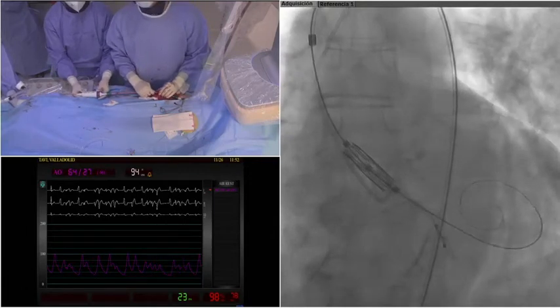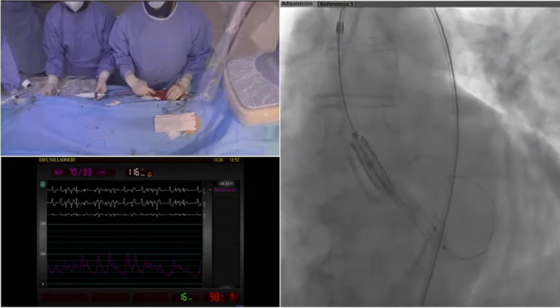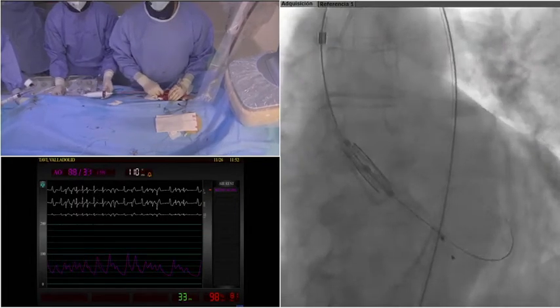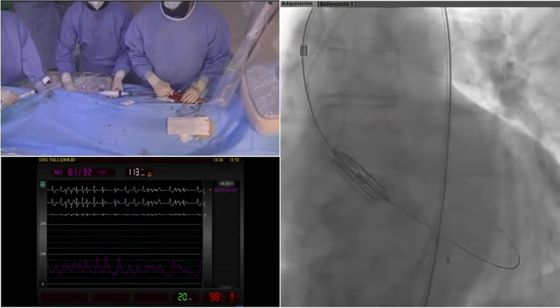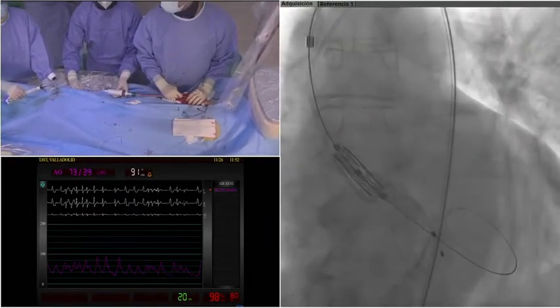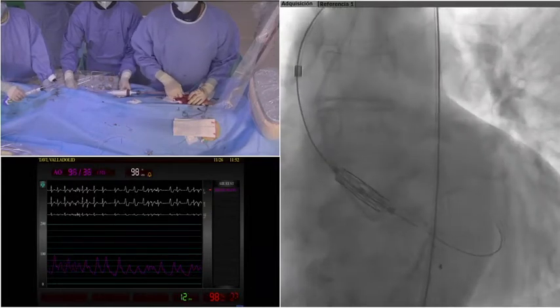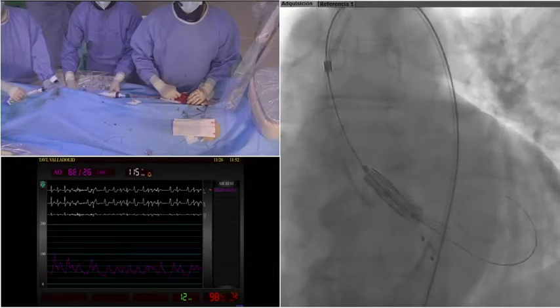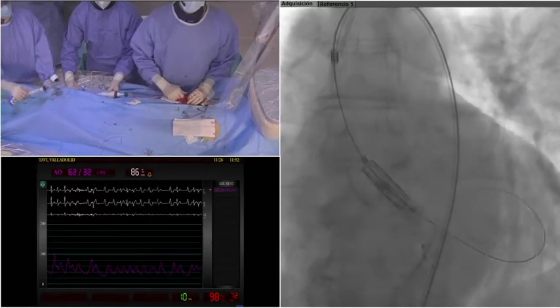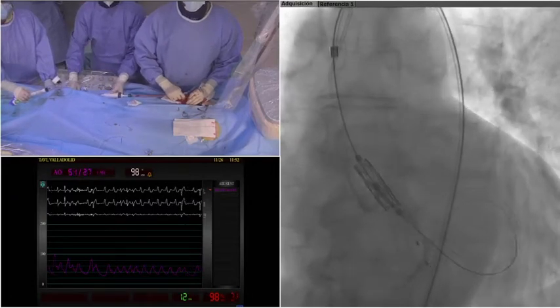We are going to remove the flex because sometimes for the crossing the flex makes it more challenging. Please push the wire, please. Okay. And pull it out a little. We are going to take a different angulation and then we cross. Okay, it's been difficult. This is what we try to avoid. But you see, even with predilation, with such calcification, okay, now we are more or less in the adequate position.